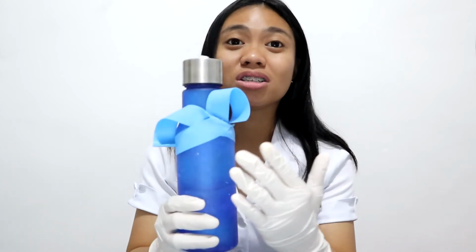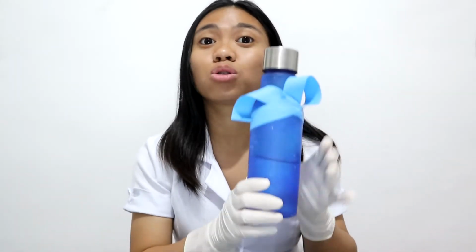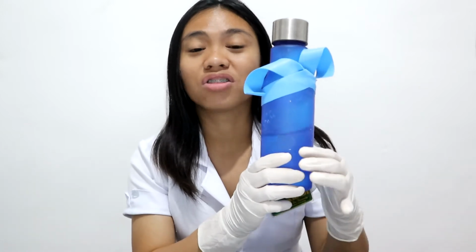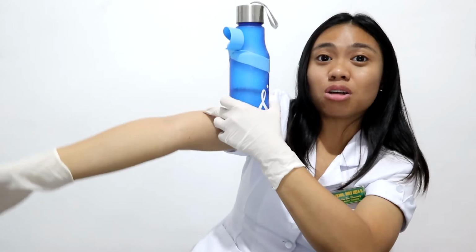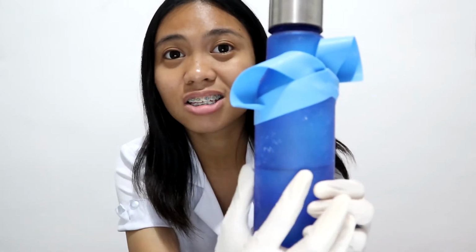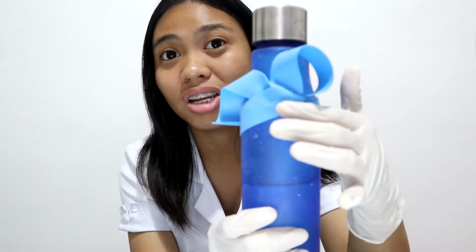There is no one certain step to do it, as long as you have your own strategy, as long as it is 2 to 3 inches above the antecubital fossa. Let's say that in this bottle, the water level is the antecubital fossa, so it should be 2 to 3 inches above it.